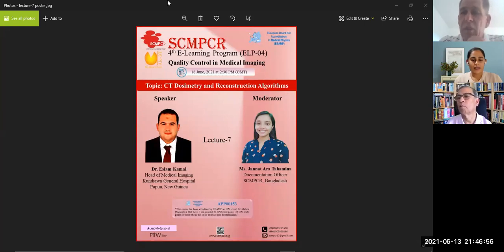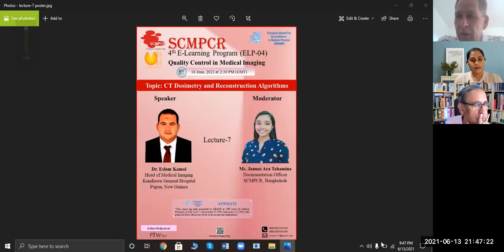But the physics mode is also a good part for trainees. For a person who needs to be educated, you can give them a project and say, okay, you log in physics mode, and you try to change the kV from 30 to 112, and you look at the exposure symmetry or homogeneity, or you look at the value if you are changing the filtering.